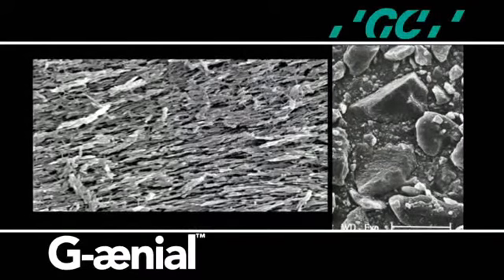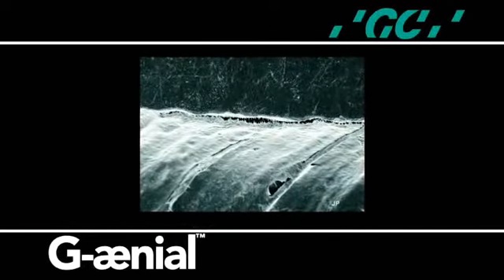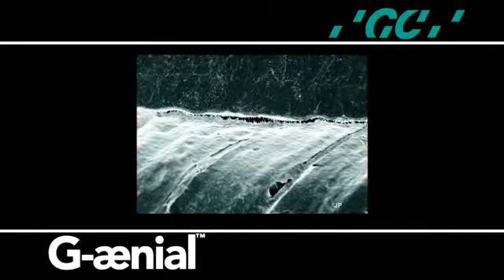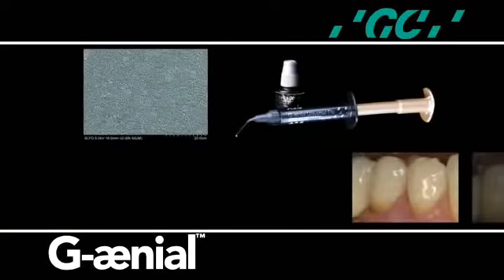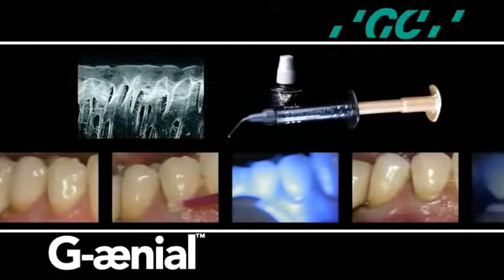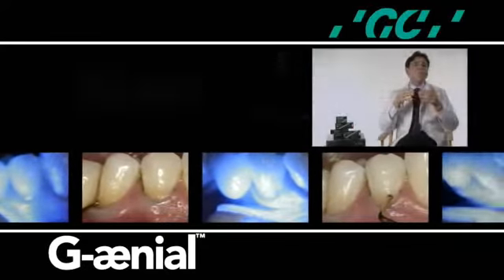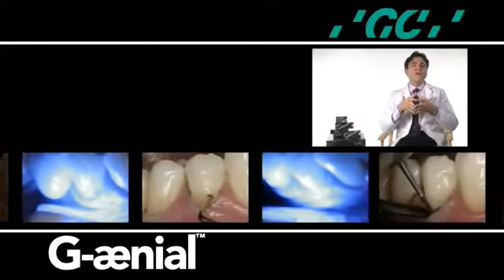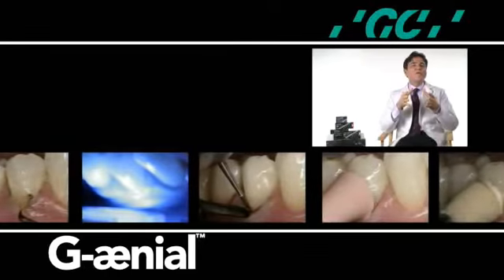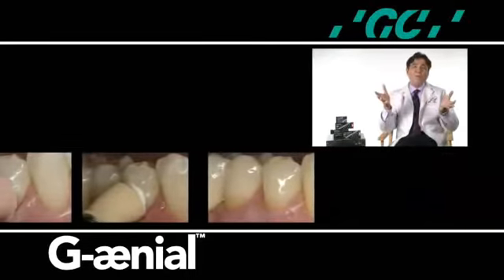the dentinal tubule, and the enamel rod. There is a potential for compromises in adhesion between the macroscopic restorative material and the nanoscopic tooth structure. However, nanotechnology has the potential to improve this continuity between the tooth structure and the nanosized filler particle and provide a more stable and natural interface between the mineralized hard tissue of the tooth and these advanced restorative biomaterials.